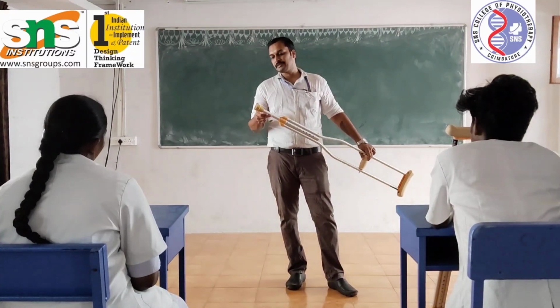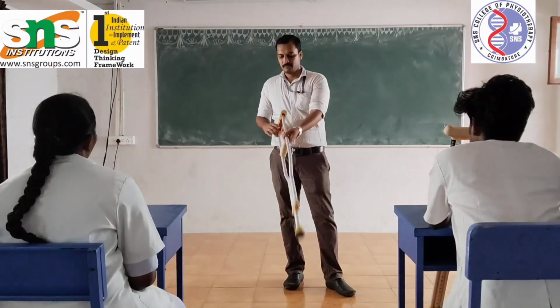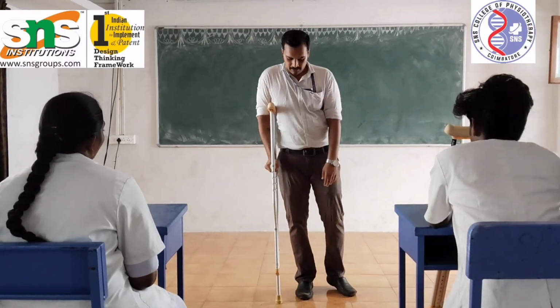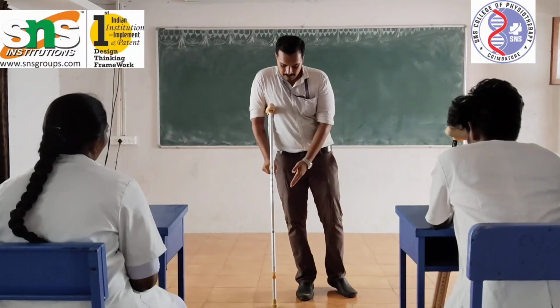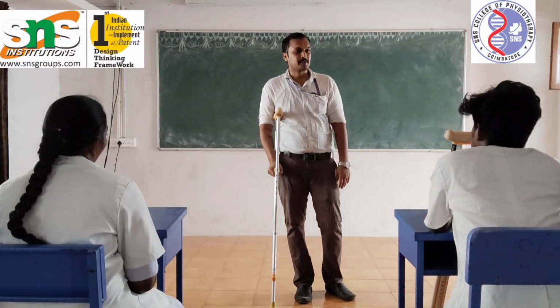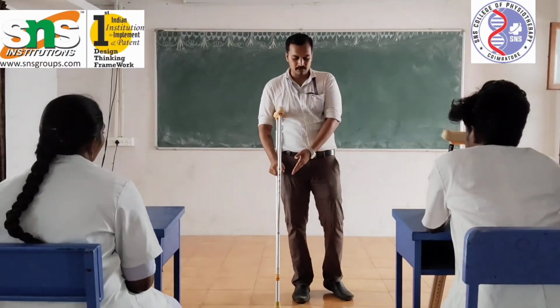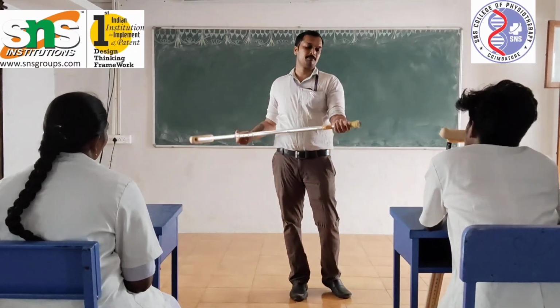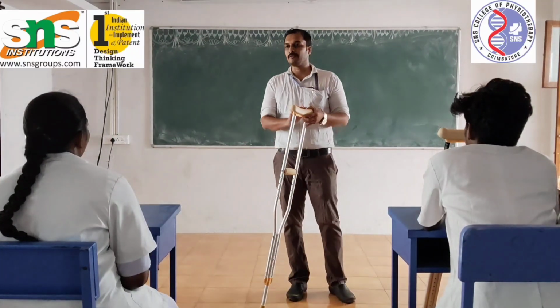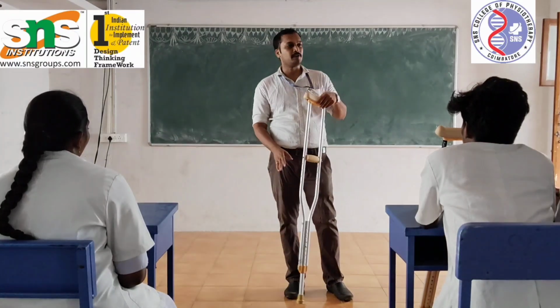Why do we name this the rubber ferrule? Because this structure alone bears our full weight while placing. If instead of rubber there were any other material, what would happen? It may slip, yes or no? But rubber won't slip. So we name this part the rubber ferrule. So these are the parts of the axillary crutch: axillary pad, hand grip, and the rubber ferrule.